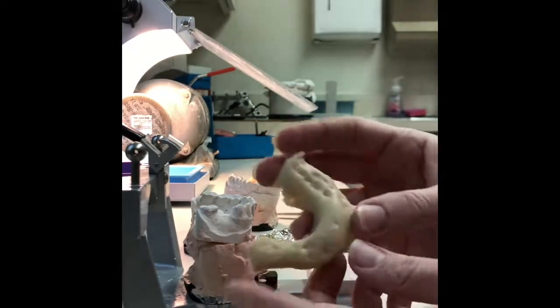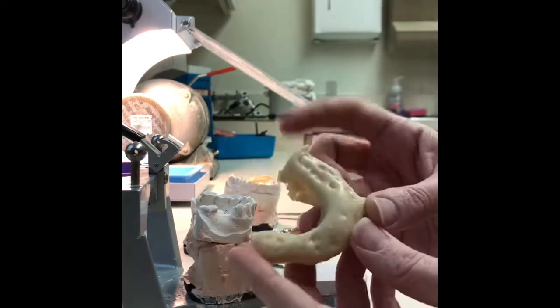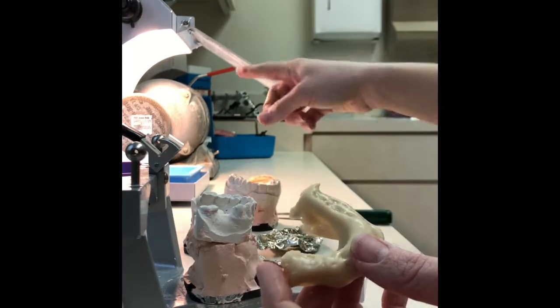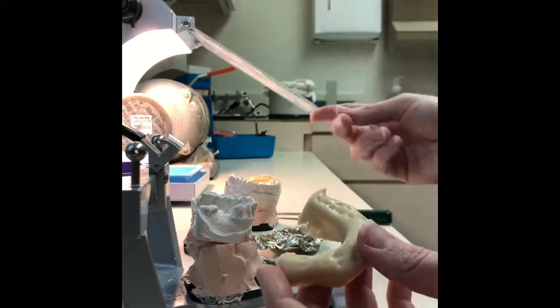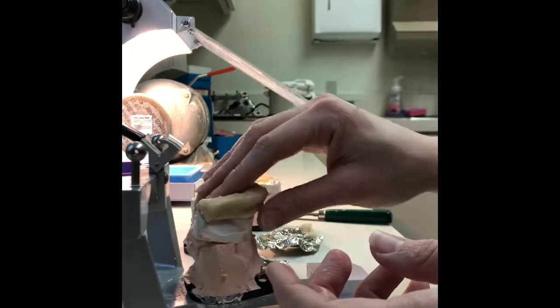And then you can see the indentations on the splint from the upper cast. Ideally that would be completely flat, but that's where we're going. So we're going to take this over to the wheel over here, and we'll trim that down quite a bit, just like we did with our bite registration. But you can see this fits.